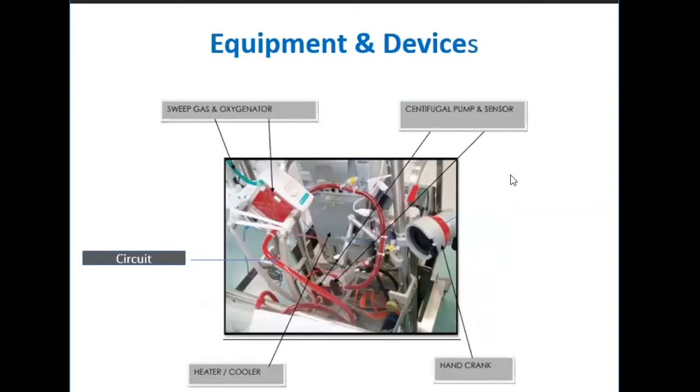Now, I will tell you about some of the important equipment or devices used in the complex machine of the ECMO.